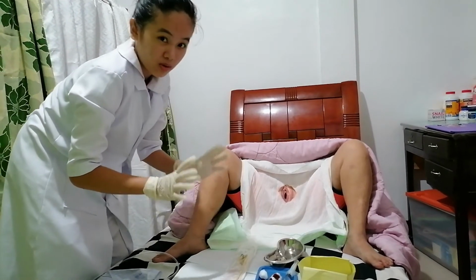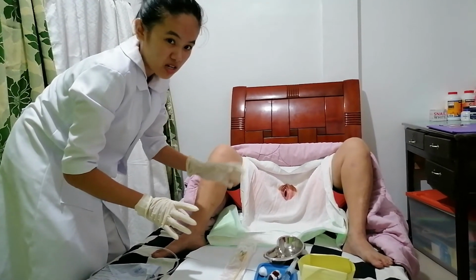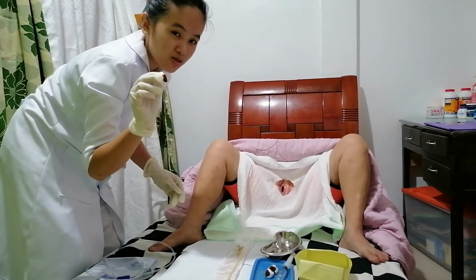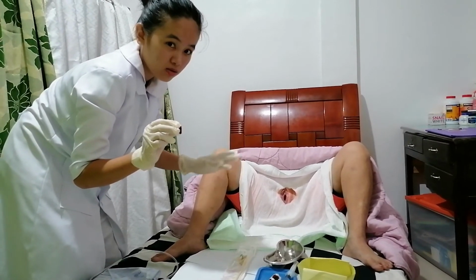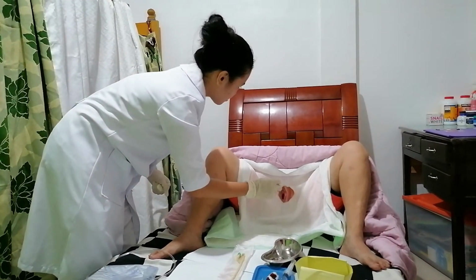And now I'm going to clean the private area of the patient. So I'm going to use this cotton ball with betadine solution, and I'm going to clean first from the inner to outer portion. Ma'am, limpyuhan na ako, ma'am.